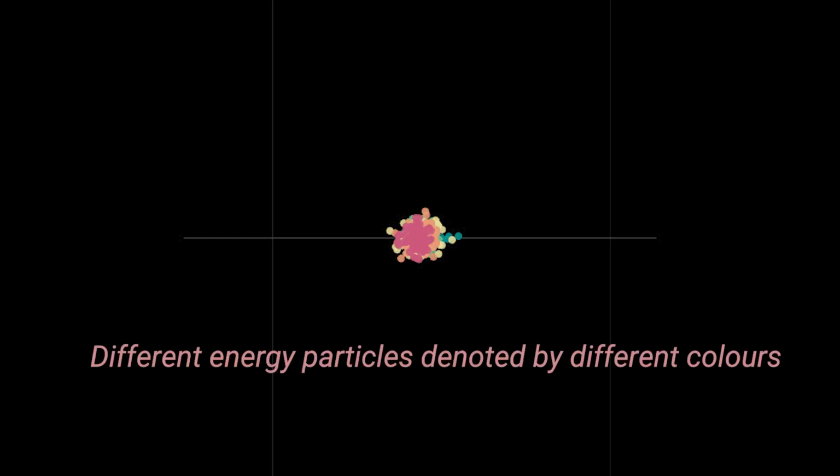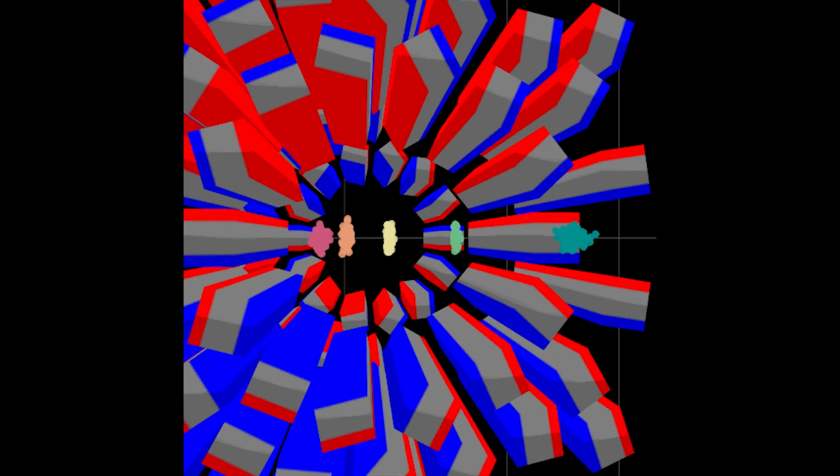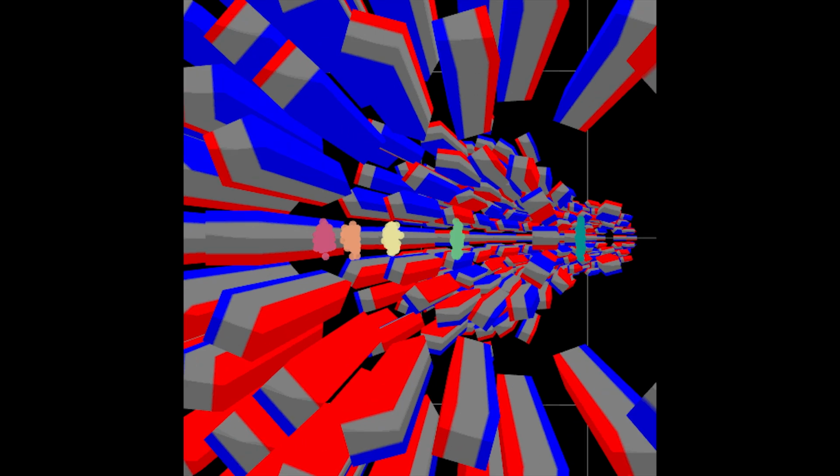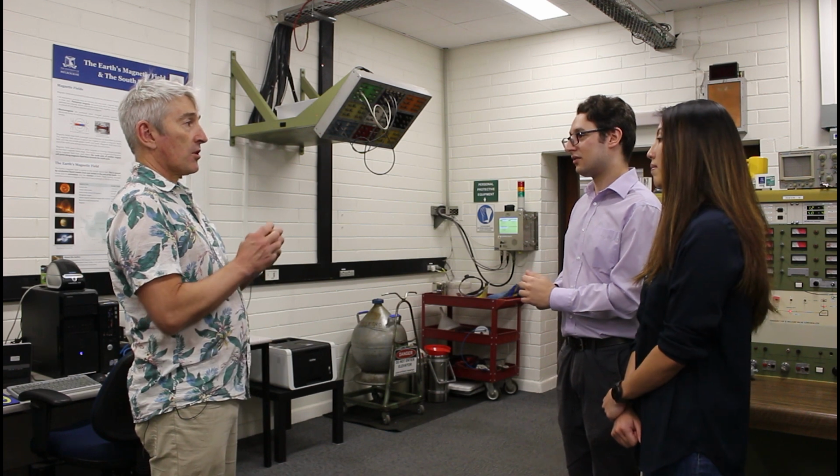So the beam starts with a large spread of energies all at one point, all on top of each other. It then starts to go through this system of magnets which separates out all these different energies, a bit like a prism for a rainbow. Separates them all out so they follow different paths. They're going through this kind of complicated arrangement of magnets which is seen around the particles they travel through. They reach a midpoint where it's kind of a symmetry point, and then everything is reversed. The particles then travel back through a mirror image of what they've already been through, and then come back to the same point with approximately the same size and approximately all on top of each other at the end. So there's a bit of symmetry, so it goes out and then comes back in.